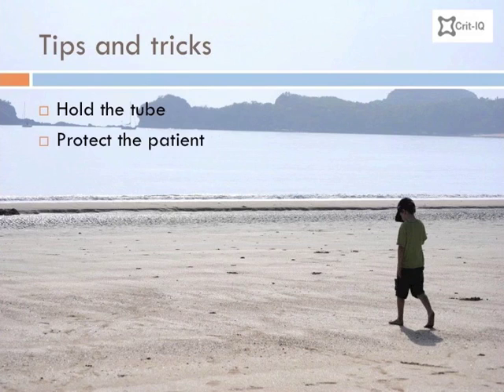Remember that the patient cannot protect themselves. Do not put equipment on the patient and ensure there is no chance of it falling on them. Take particular care of the patient's eyes. A high degree of vigilance is required when transporting patients. The transport environment can be very loud and distracting, so it is important to be disciplined in paying attention to the monitoring.